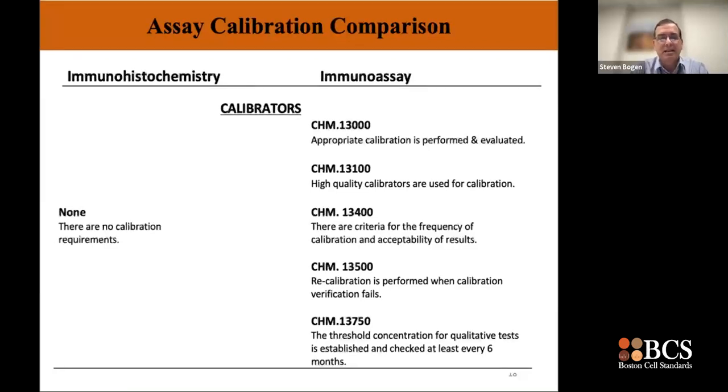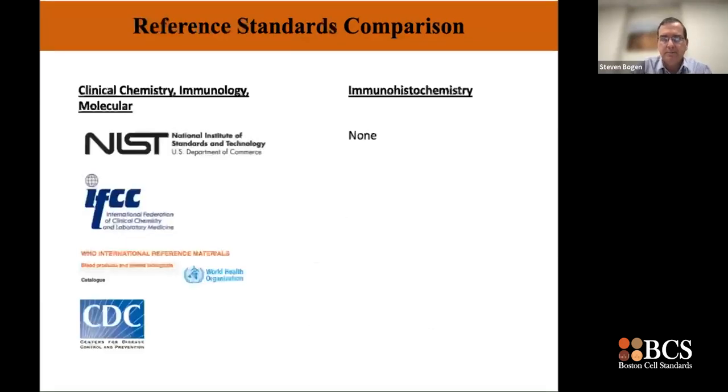In fact, it is the process for standardizing laboratory testing around the globe by linking assays to a primary reference standard. It is required even for qualitative assays like IHC that are reported as positive and negative, because, as I'd mentioned previously, calibrators establish the threshold distinguishing positive from negative test results.